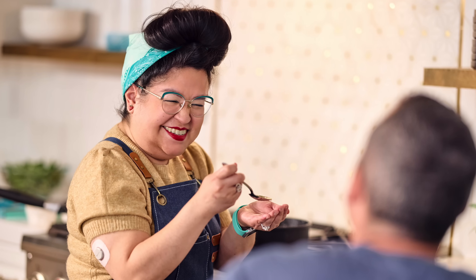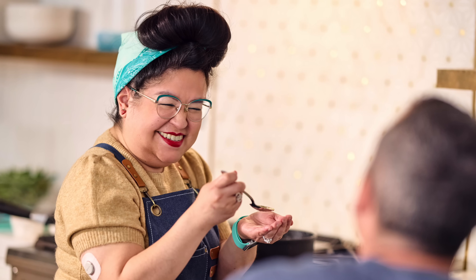Who is this sensor for? It is for people 18 years and older. That means if you are 17 and younger, you're going to have to stay on the 10-day. Dexcom hasn't said if they're going to try and lower the age on this — I can only assume they will. I'll get into some other sensors, the competition, which do support younger ages at that 15 days. But for now, the 15-day sensor is just for adults.